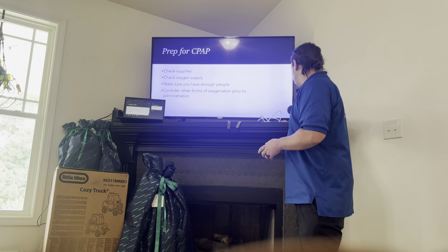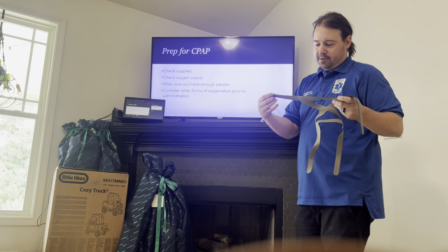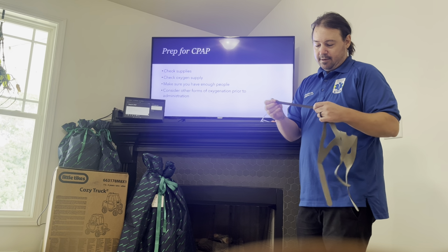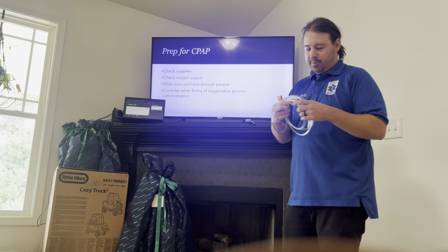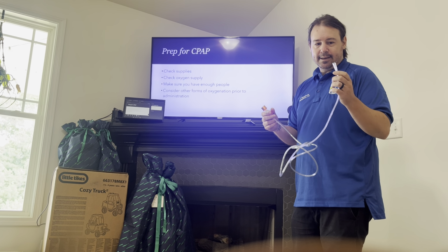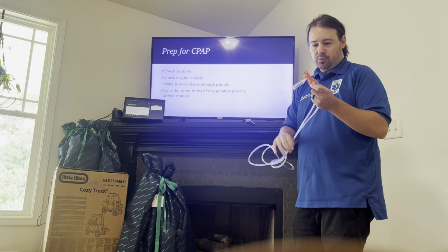All right, when we go ahead and talk about your straps, just make sure that your straps are there, more or less. Make sure that you're using a new strap so that this is not already been pulled taut, and it would loosen your seal. And then this, you just need to make sure that it has all the correct pieces and that you're connecting it to the oxygen source, and as long as the oxygen is coming through, you are doing a good job.